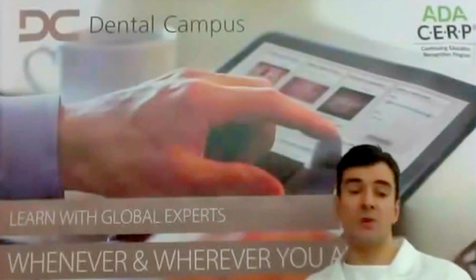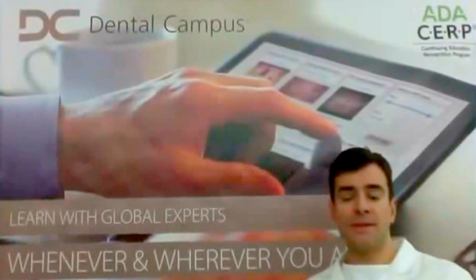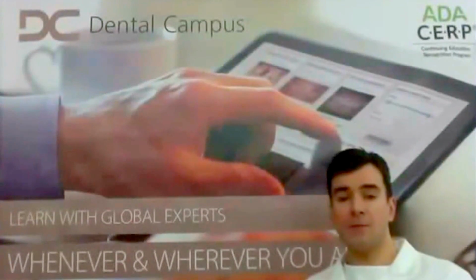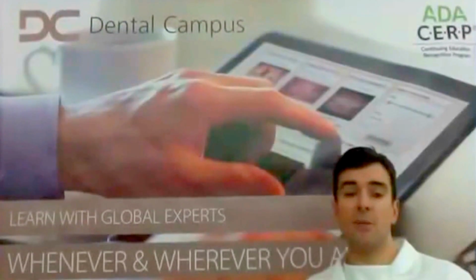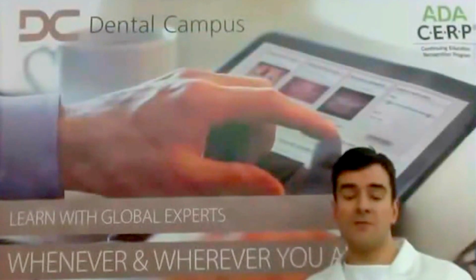So either we use a classical, let's call it, removable partial prosthesis with wire clasp. So this is a typical reconstruction which we use. Or the other option is to use a thermoplastic splint, which can be added with some resin for the missing tooth.